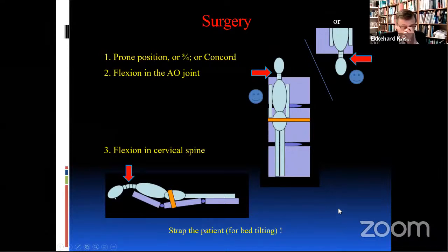Now, for surgery, there are various ways how you can position the patient, and I always recommend you go with things you're most familiar with. So I'm a right-handed surgeon. I usually stand on the left side of the prone patient. The patient is head up, anesthesia sits here, and the key motion is that I do a midline approach. The same can be done upside down. Some of my colleagues operate with the head towards them, and there's a Concorde position that can be used, or for more unilateral exposures, you can use Fukushima's. The key is flexion in the cervical spine to improve your viewing angle.